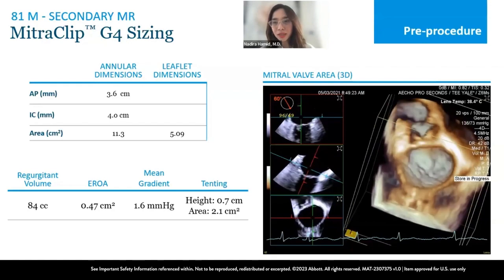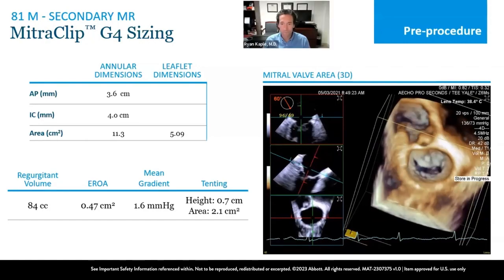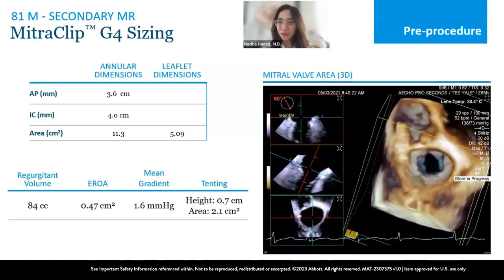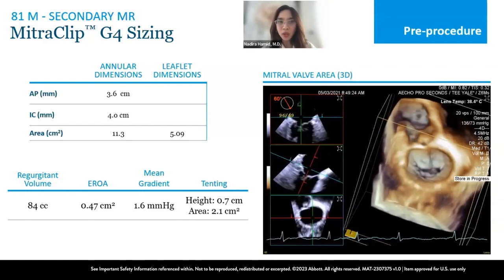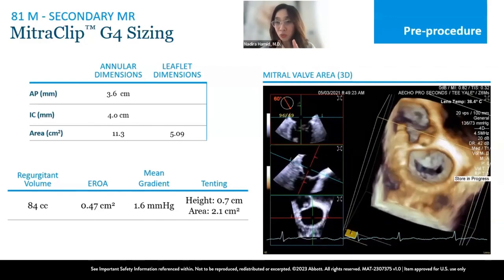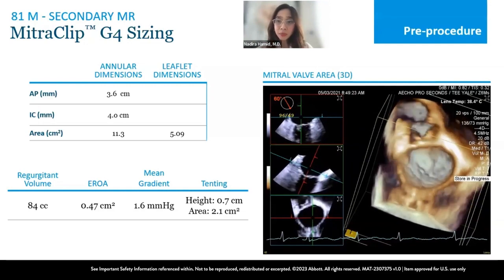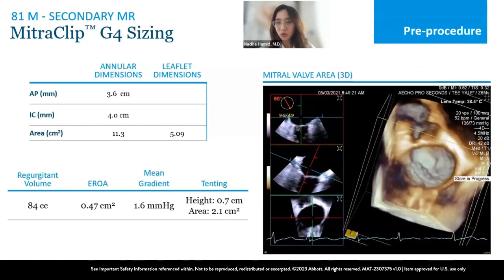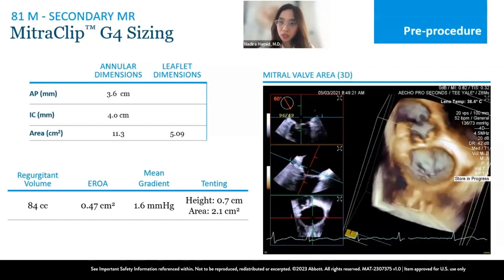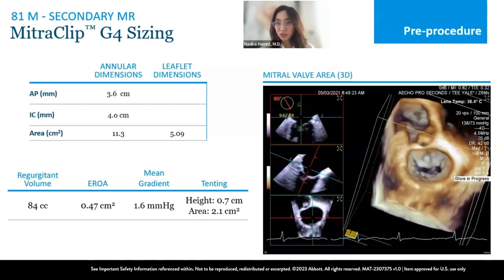That's a great question. I think it does play a huge role. I think the tenting height would matter in terms of the transseptal. And if you don't have enough height, especially for the functional mitral regurgitation, don't you think it can give a little bit more room in tenting area as well? And I think the point of coaptation reserve, if the tenting area is not so large, and the height of it, the coaptation reserve is so small, it's acceptable, still doable, but challenging as well. So these are the kind of things to think at the back of your head as you grasp these leaflets, and to make sure that you have adequate leaflet length grasped into that clip to avoid that SLDA, and you want to get as much MR reduction as possible.